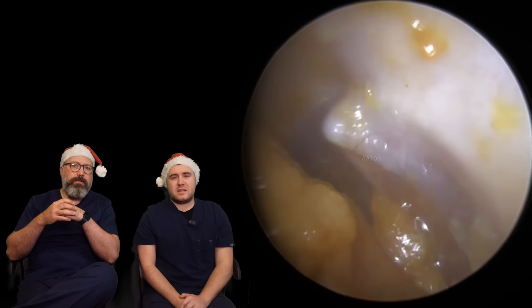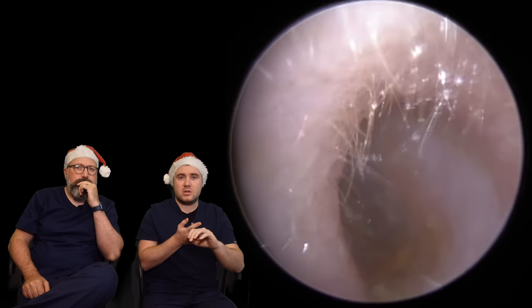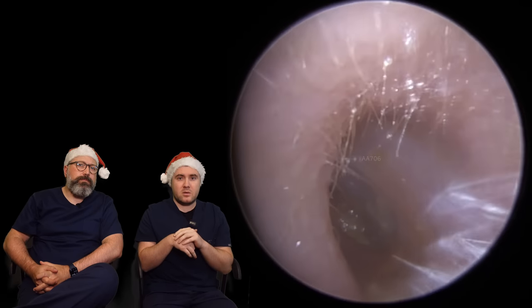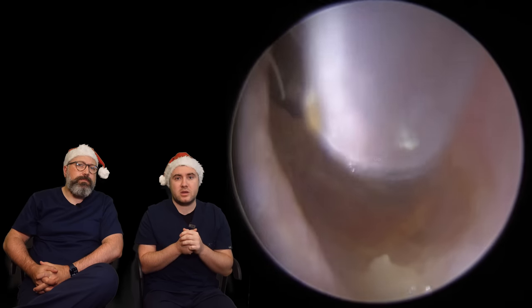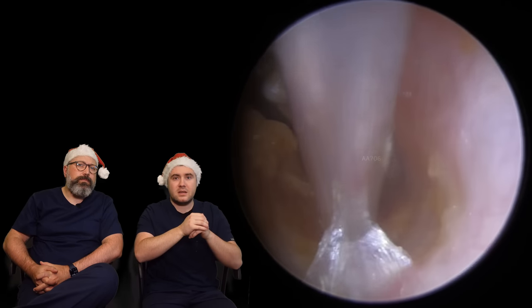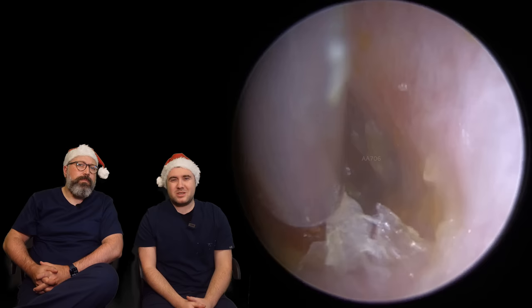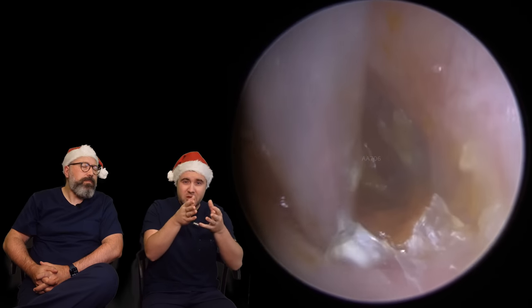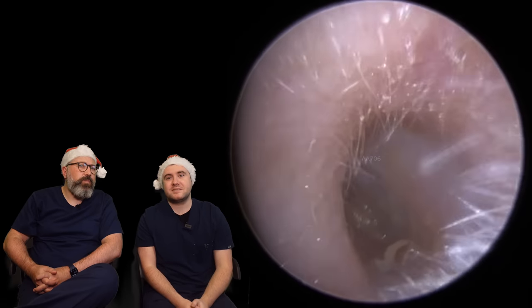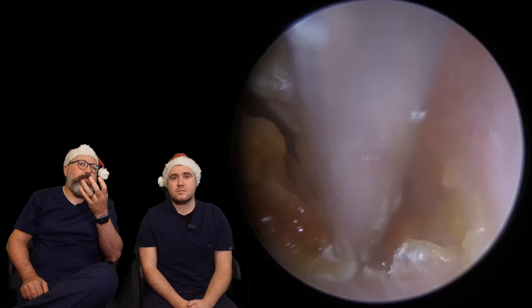A very different story on this side though — same patient. You can already see part of the eardrum on this side, but this wax is obviously a lot softer. The patient has used more drops on this side because this is the ear she was having problems with hearing-wise. No pain associated, no discomfort, just a really blocked-up sensation. Not surprising, because this soft wax has really got itself stuck and wedged right in front of the eardrum in the anterior recess. There's also a lot of dead skin in here. We're gently trying to peel this down the ear canal, hoping it's going to start pulling up some of those thicker, softer bits deeper in there.